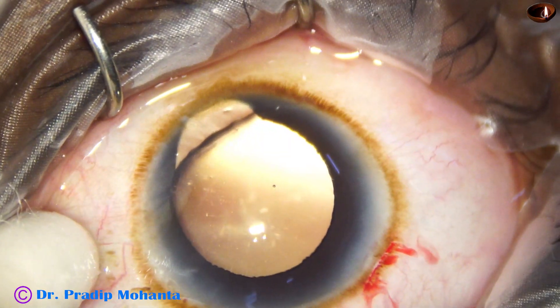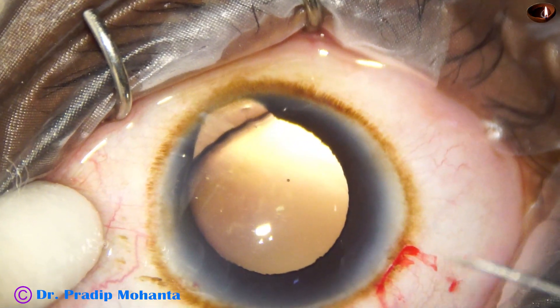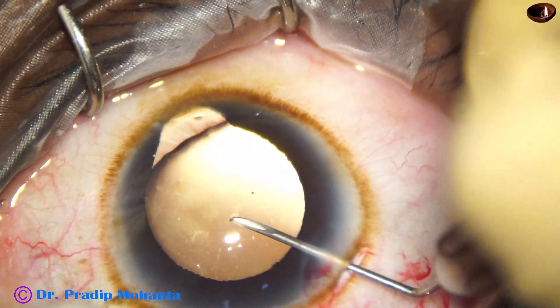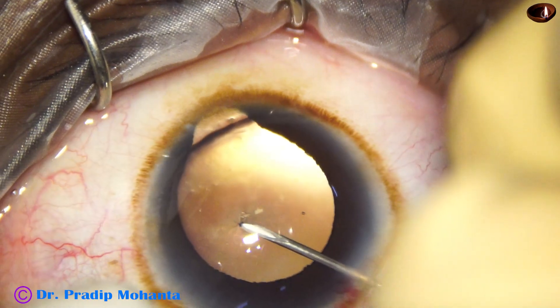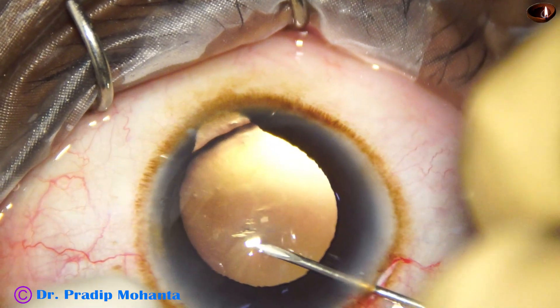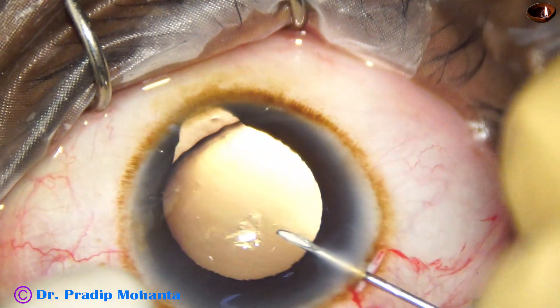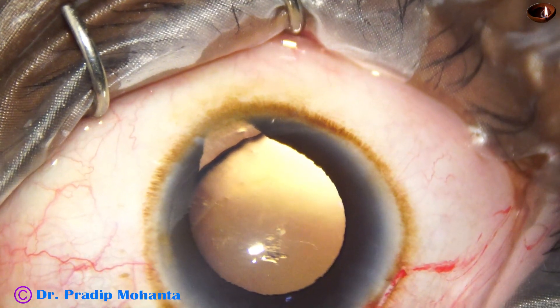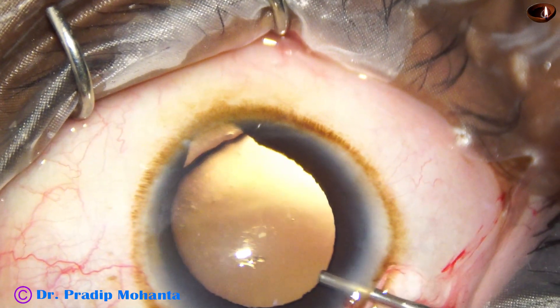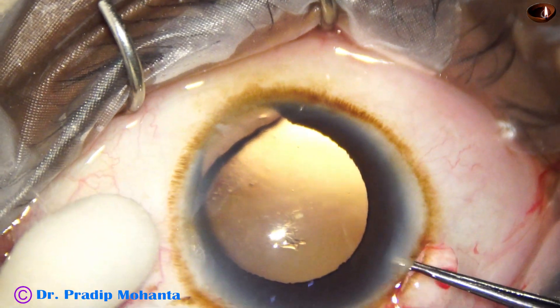The main incision has been placed on the sclera just behind the limbus, and now the anterior chamber has been filled up with visco. I am trying to get a capsular tag by the needle — the zonules are very weak. There is 2 clock hours of zonular defect, from 4 o'clock to 6 o'clock. My plan is to use a capsular tension ring before I start aspirating the lens matter.